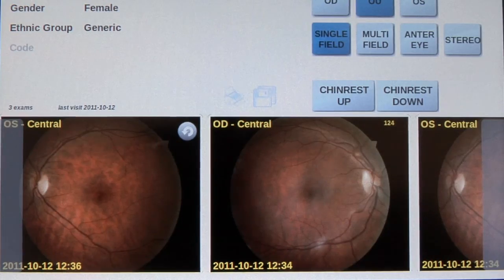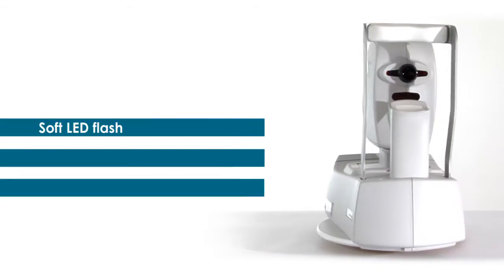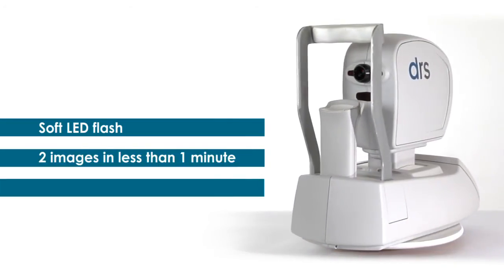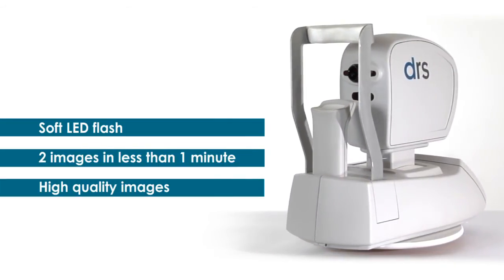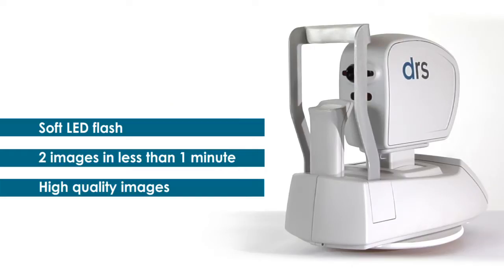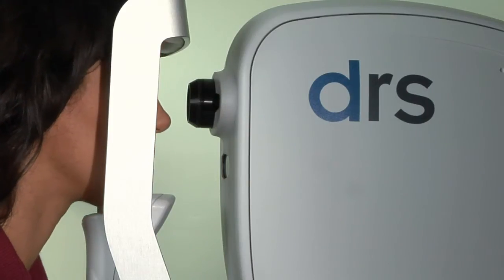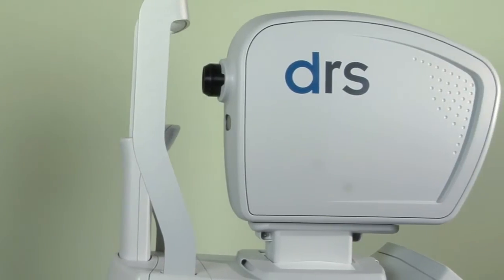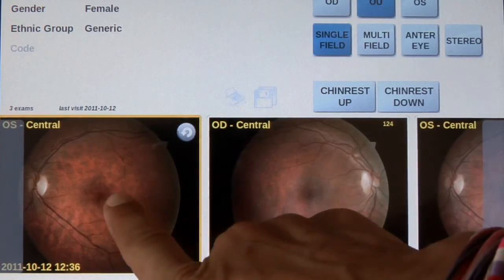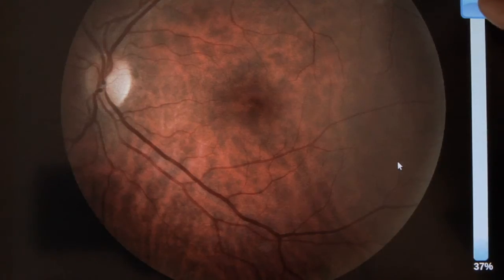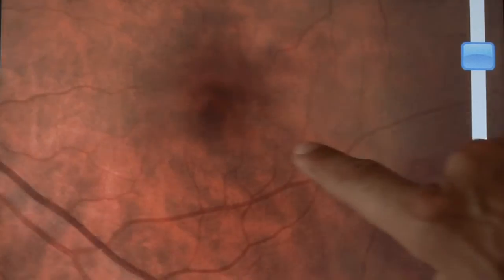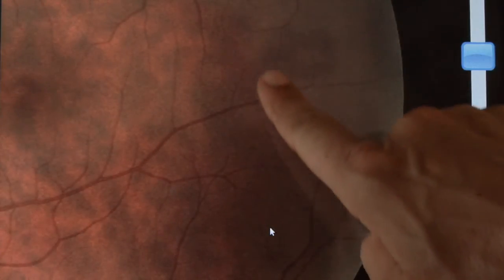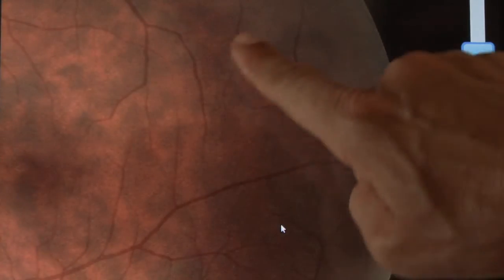In less than one minute, the DRS generates two high-quality images — one for the right eye and one for the left eye. Because it uses a soft LED flash, the DRS is very patient-friendly. It quickly and accurately captures digital images of the central retina without pharmacological pupil dilation.